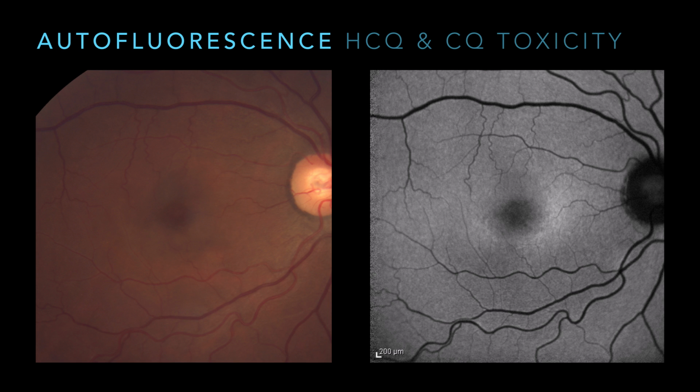It's getting harder and harder to get multifocal ERGs, so it's just good to know what your experience is on that. So we'll probably have to switch to the SD-OCT. I like SD-OCT. Again, I don't have Dr. Harrison around the corner. I love sending my patients to him. His reports are beautiful. Multifocal ERG is not going to be quite as specific either. And that's one thing about spectral domain OCT. I'll show some images later when I get to that part.